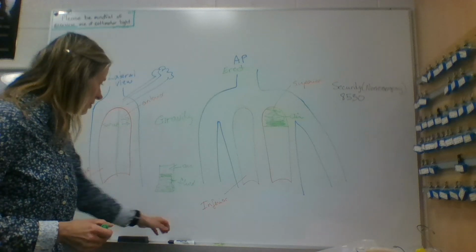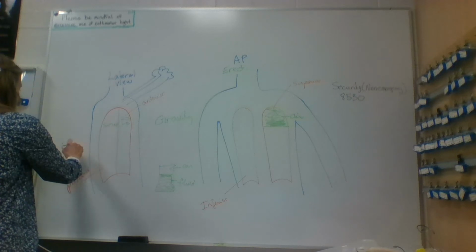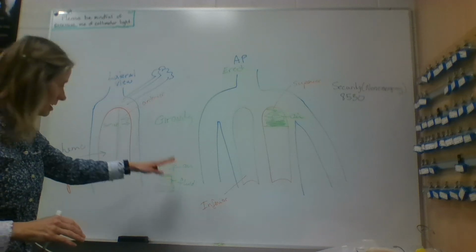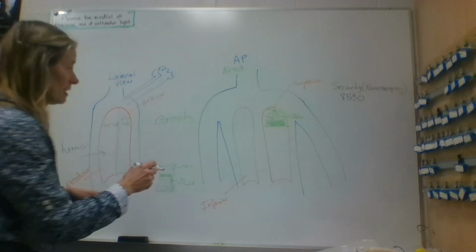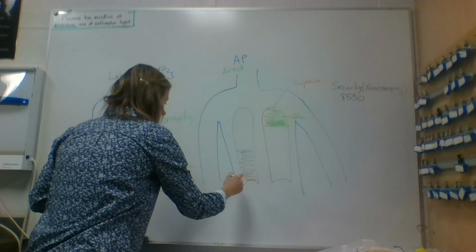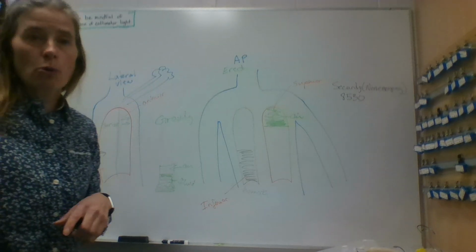Compared to a hemothorax, where the chest tube is different: now the chest tube is going to be inserted in the posterior part of the chest, because as we lie down, gravity is going to make sure that the fluid is in the most dependent part. And in an upright projection, we have fluid or hemothorax in that same location as well. So just the location of the chest tubes will let you know what's going on with that patient.